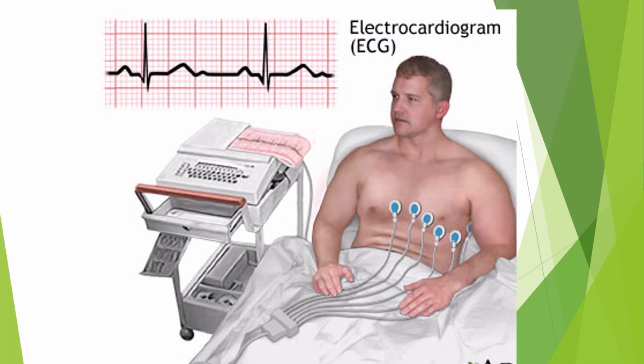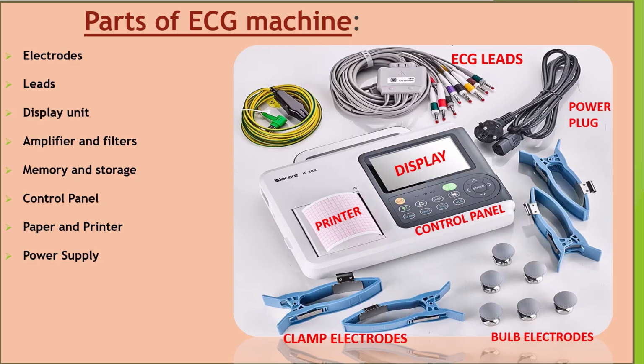Electrodes should have full contact with the patient's skin because the heart's electrical signals are transmitted to the electrodes. So make sure the electrode conducting gel is fresh and adequately moist, because a dry electrode with inadequate gel reduces the conduction of the ECG signal. Electrodes should not be placed over bones or over areas where there is a lot of muscle movement, to reduce artifacts.